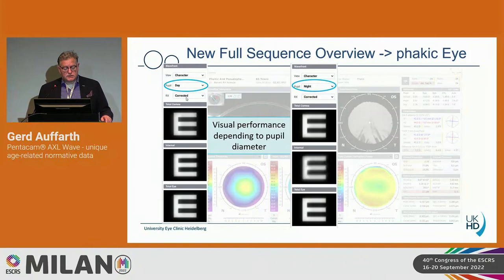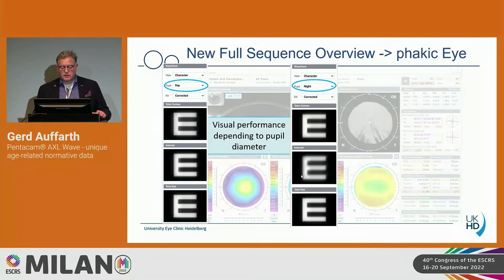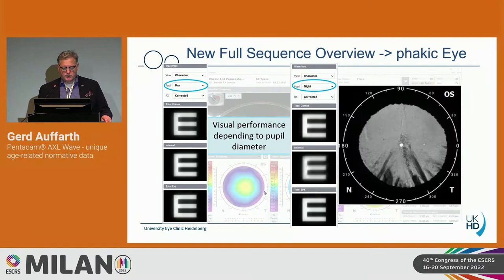There's an interesting visual performance feature showing total eye aberration, corneal, internal, and total eye aberration, all related to pupil size. During the day a patient looks a certain way, but at night when the pupil is larger you can see there is an issue and vision quality becomes worse — a very interesting new feature. There's also a retroillumination photo, a little bigger than in the previous overview sequence.